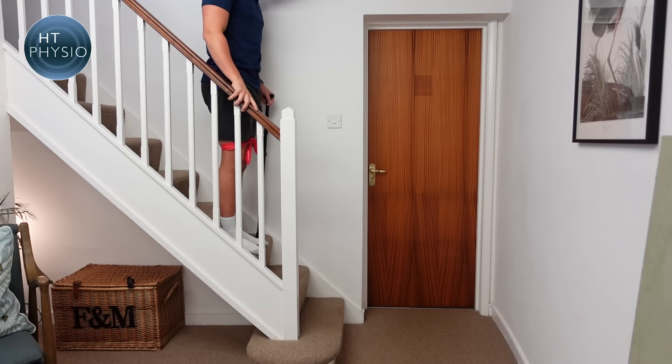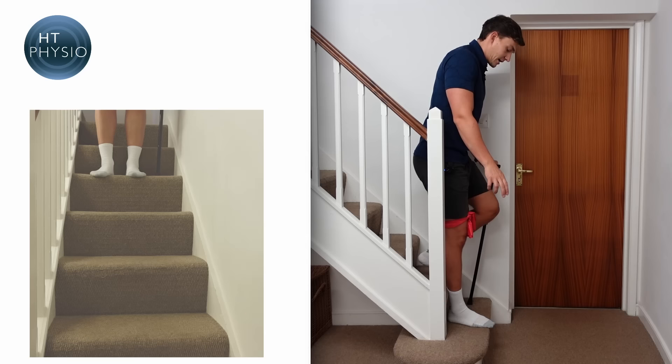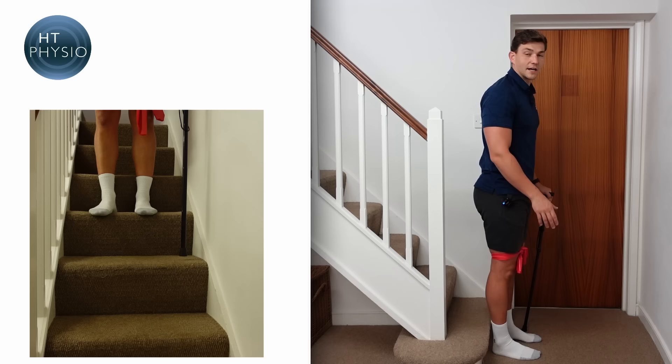Now with the injured leg on the opposite side, nothing changes with regard to our hands. We slide our hand down the handrail, then the stick, then the bad leg, then the good leg — the same sequence repeated for each step going down.